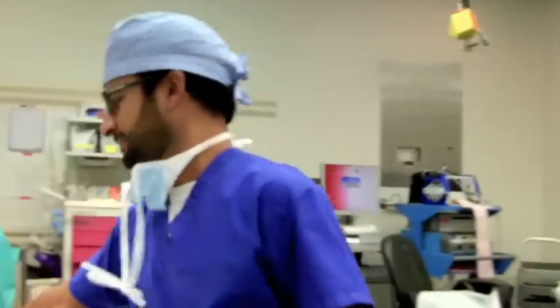Time out. This is patient Joseph Smith. We're going to be performing a spinal anesthetic. The consent has been obtained, and I will now place a pulse oximeter and non-invasive blood pressure cuff on the patient.